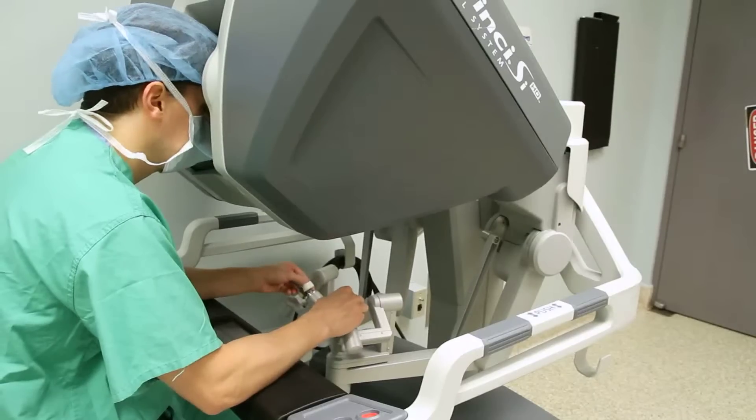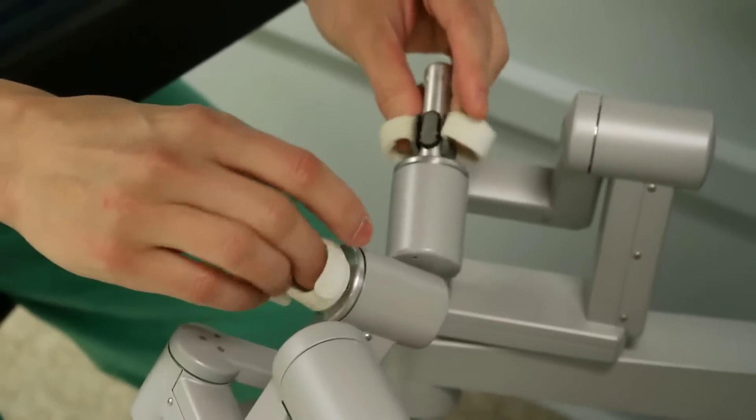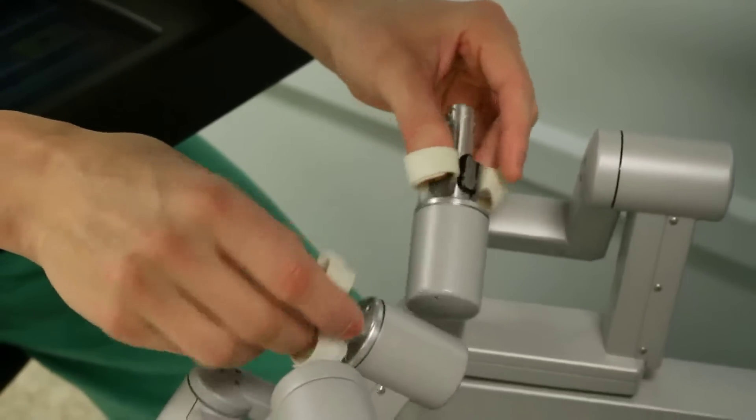These arms are controlled by the surgeon who sits at a console that is located several feet away, and the console has joysticks that the surgeon controls, which the robotic device mimics exactly, matching the motions of the surgeon's hand and wrist.